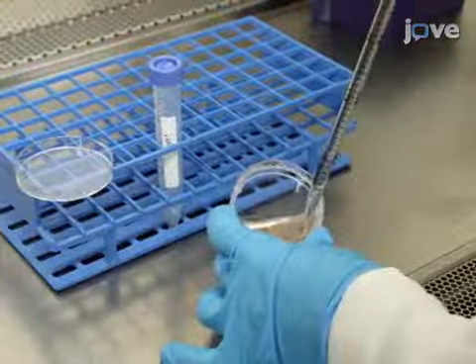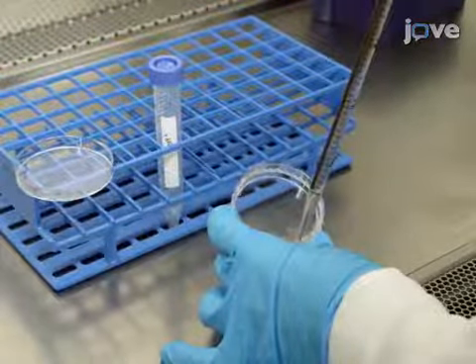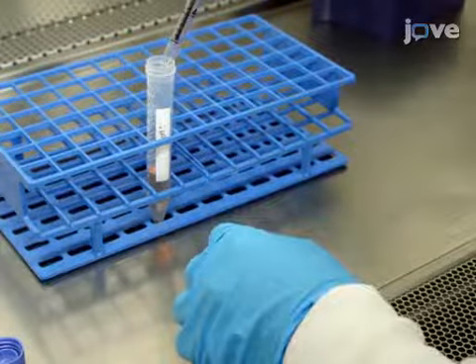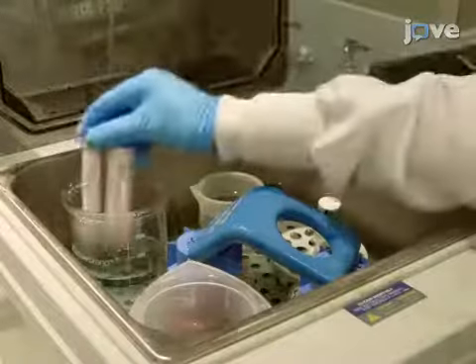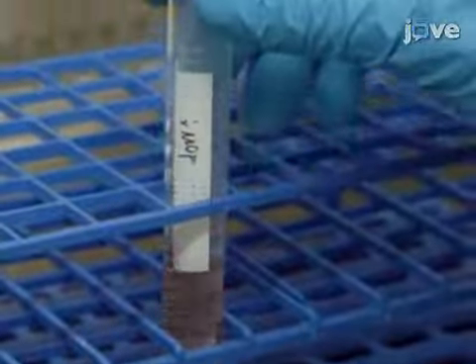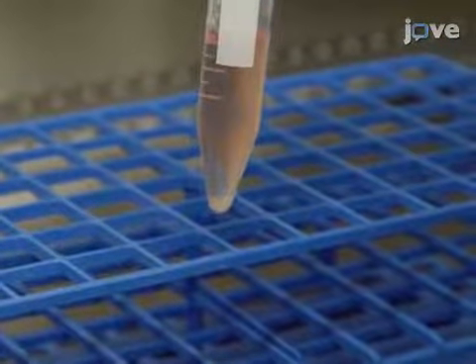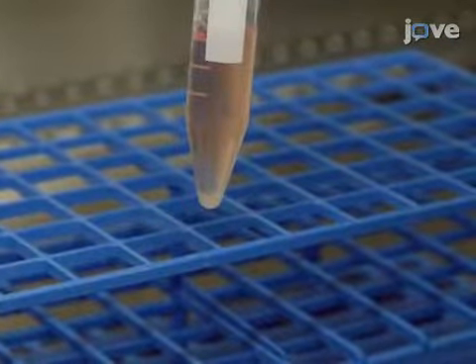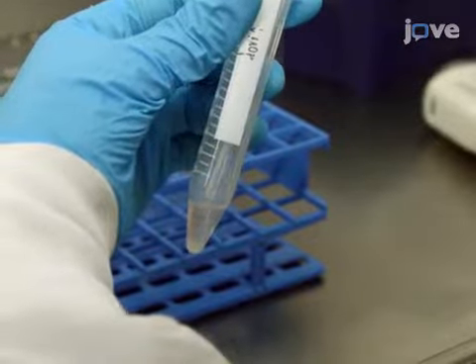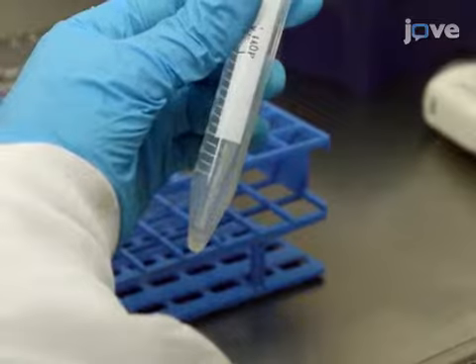To passage the cells, first transfer them from the culture dish to a 15 milliliter conical tube, and then place the tube at 37 degrees Celsius for 5 to 10 minutes. During this time, expect colony-forming otospheres to collect at the bottom of the conical via gravity sedimentation. Next, aspirate the supernatant, being careful not to disturb the pellet.